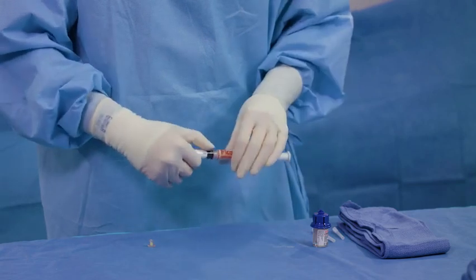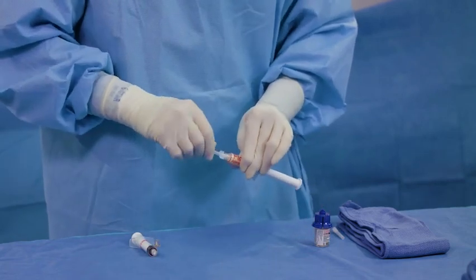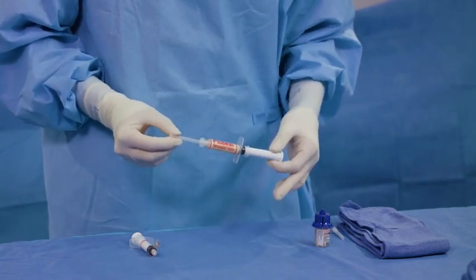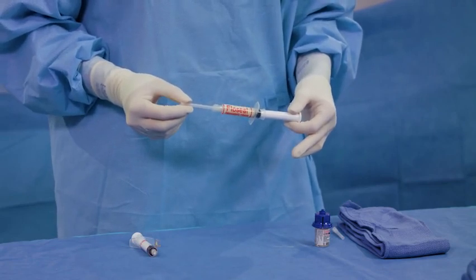FlowSeal Matrix may be extruded directly from the syringe. If desired, connect an applicator tip to the FlowSeal Matrix syringe. Allow 30 seconds after preparation before FlowSeal Matrix is applied to ensure optimal product consistency. FlowSeal Matrix may be used up to 8 hours after mixing with the thrombin solution.